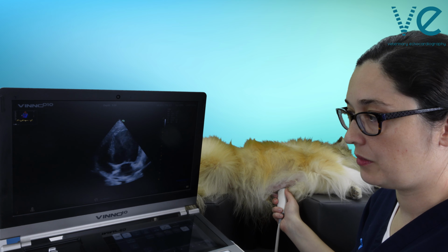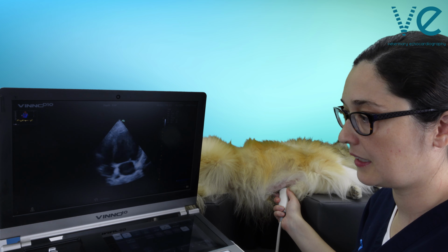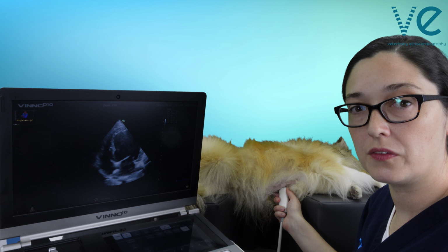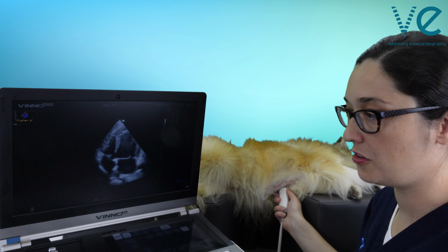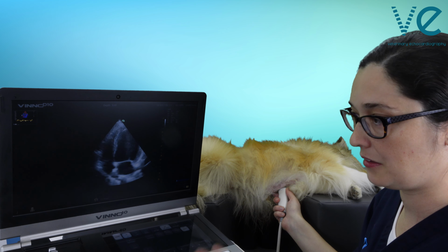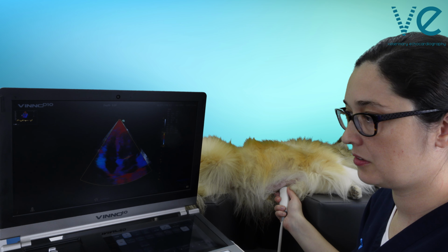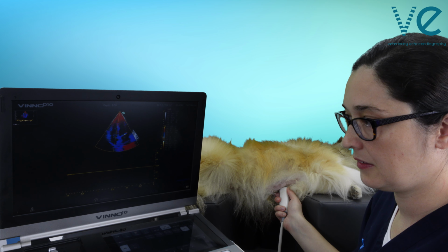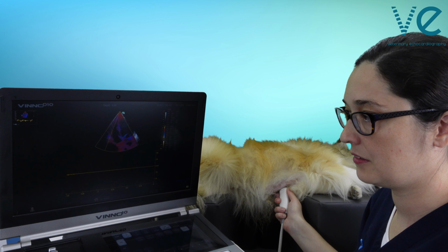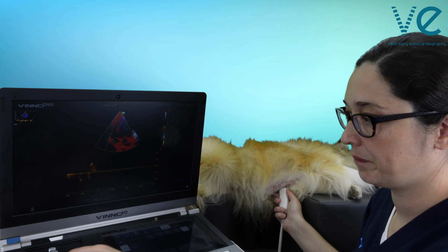Now let's move over to the right ventricle. So you can have an RV focused view if you like. Try and get it again nice and on axis. You're looking at longitudinal function, so you want that tricuspid annulus to be moving up from your perspective. Remember, you're up at the apex, you want to see it moving up towards you. And then you're going to put your TDI back on, and now you're placing it here where the tricuspid valve is inserting into the RV free wall.